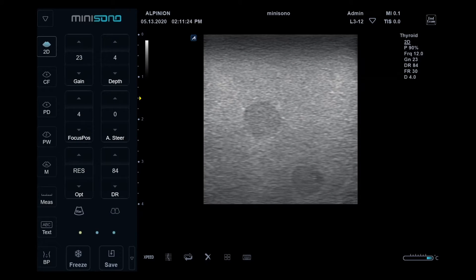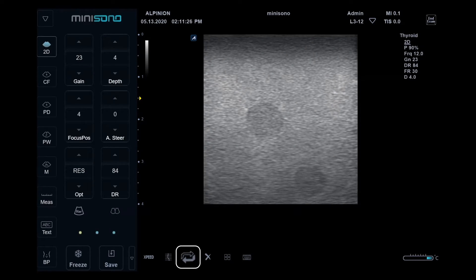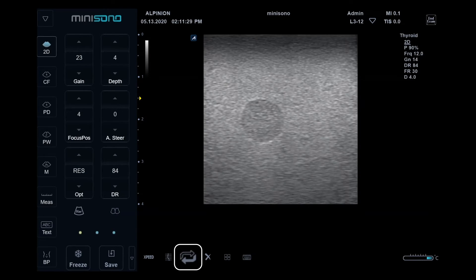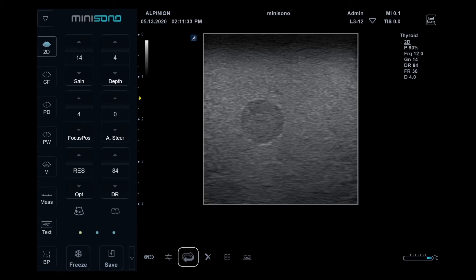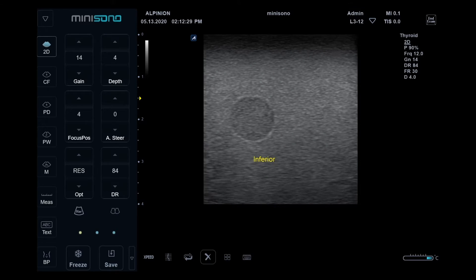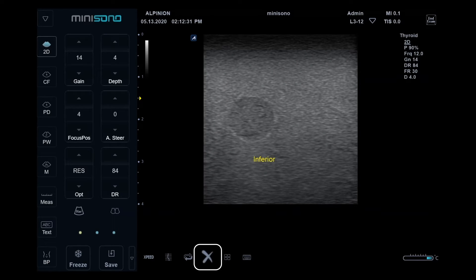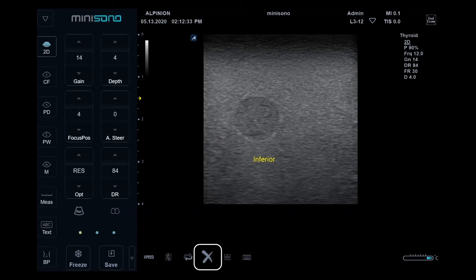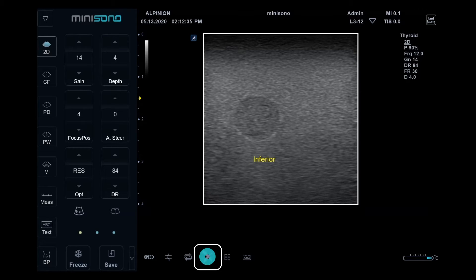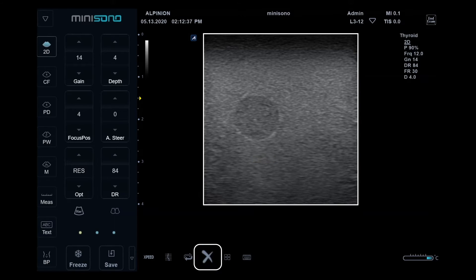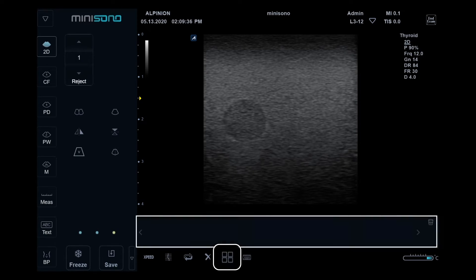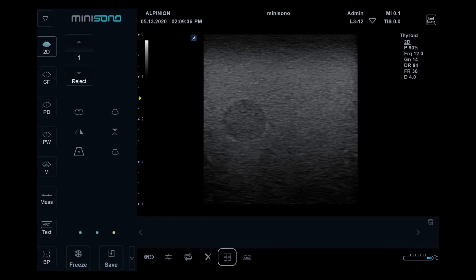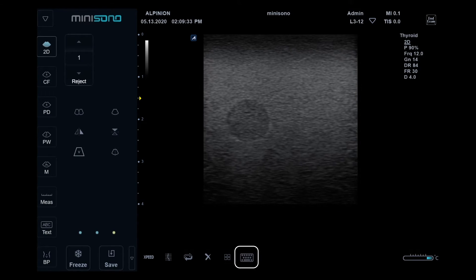Next is TGC Slide. The Initial button, when tapped, resets the preset. The Clear icon removes measurements and annotations once tapped. Clipboard lets you review stored images. Virtual keyboard is also available.